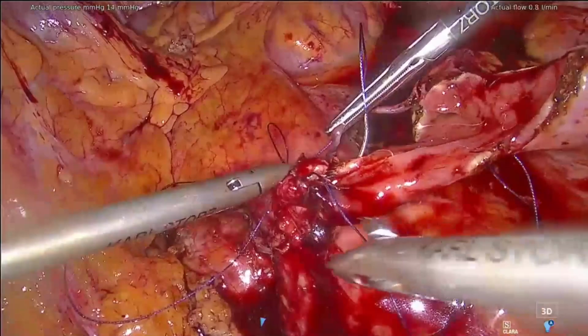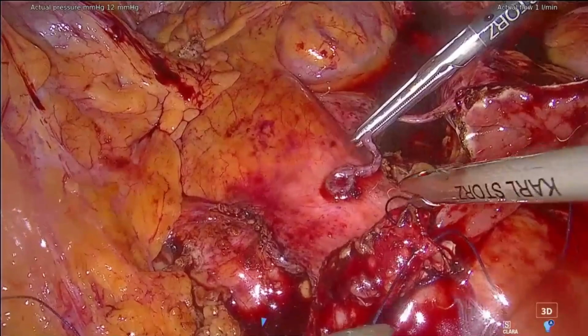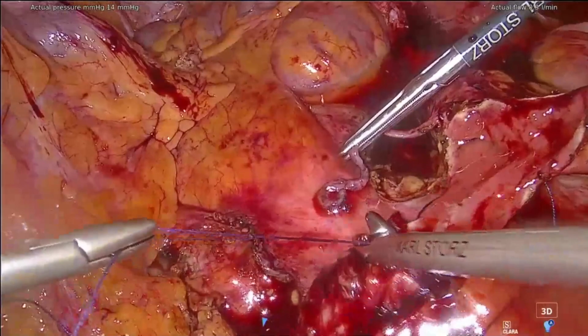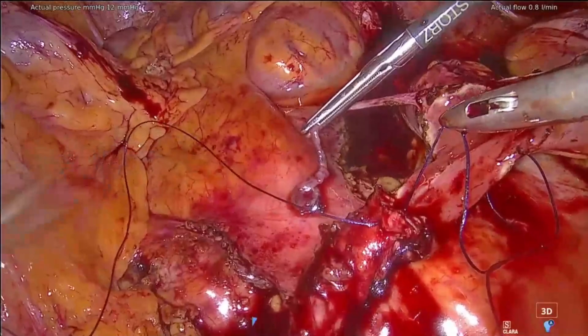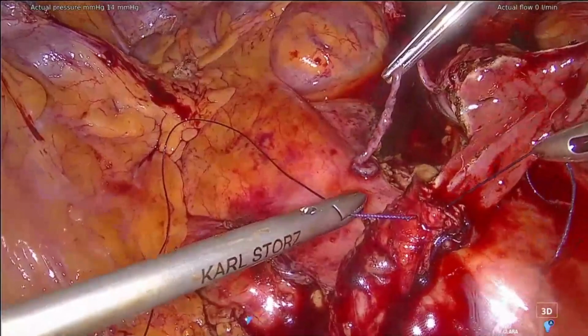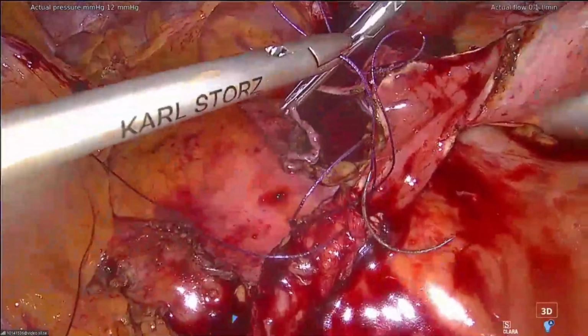Okay, now I finished my anastomosis. And normally it should start to be like a tube if I calculated well. Yeah, more or less. And I have to go a little bit more with the other one. Where am I? I'm inside. Oh, yes, I'm inside. That's strange. Can you clean here a bit?